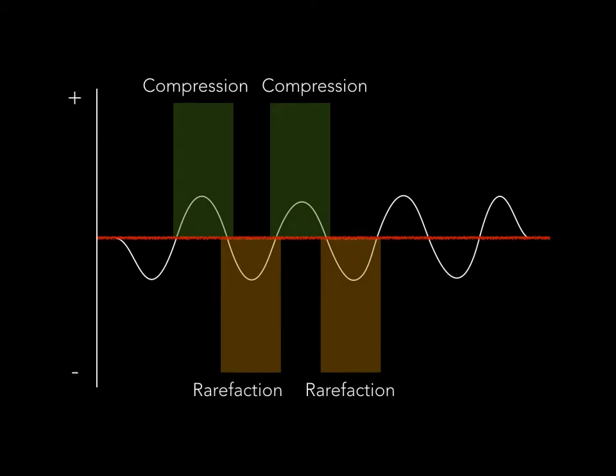On the x-axis, there's time, and zones of high and low pressure are alternating. The area between two identical parts of the sinusoidal wave is called one cycle.